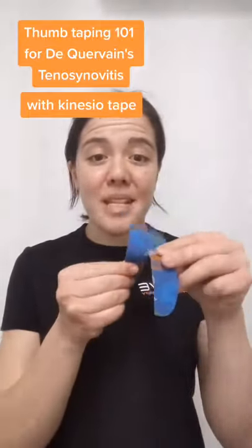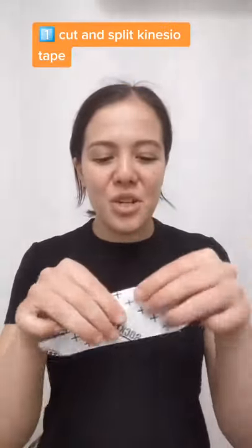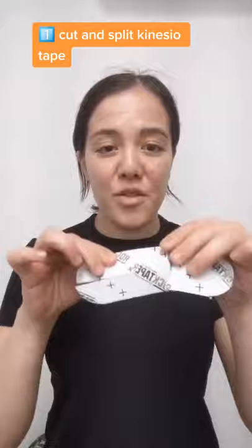Here's a quick taping technique for de Quervain's or mum's wrist. You will need some kinesio tape that has been split down the middle. All you'll need to do first is rip the paper so that it's easy to take off — in the middle and also at each end of the little split.